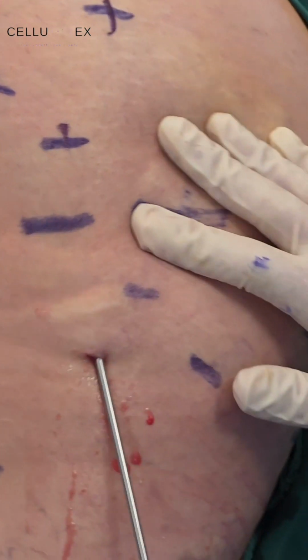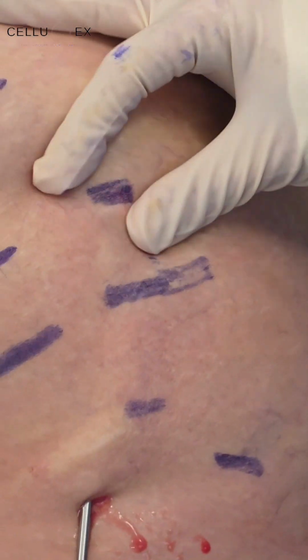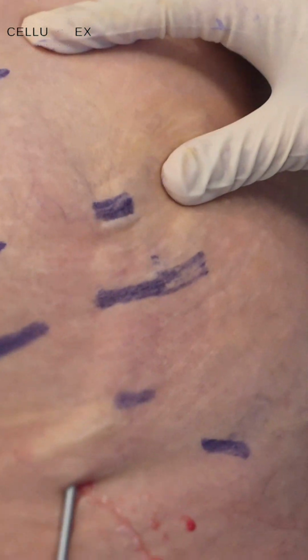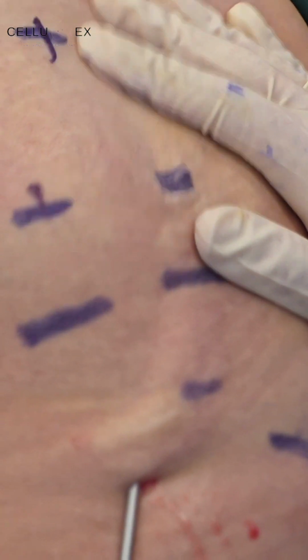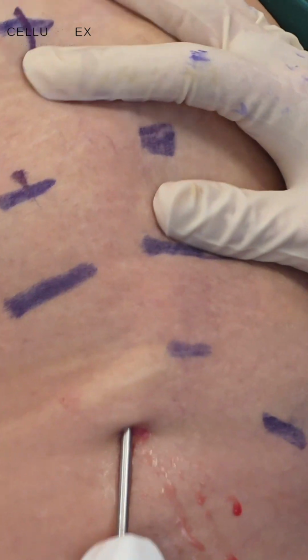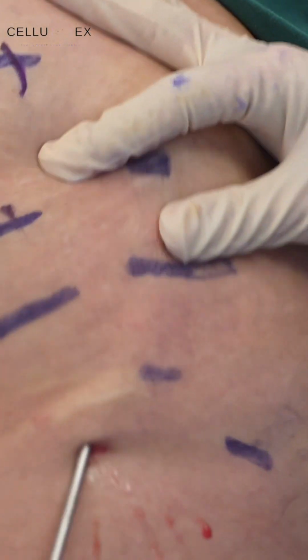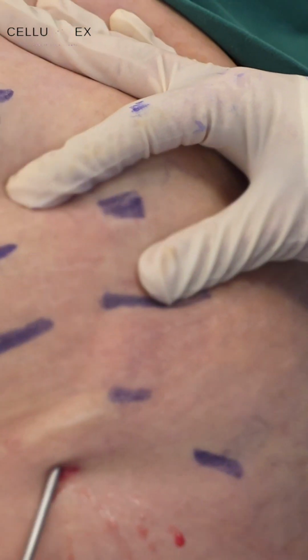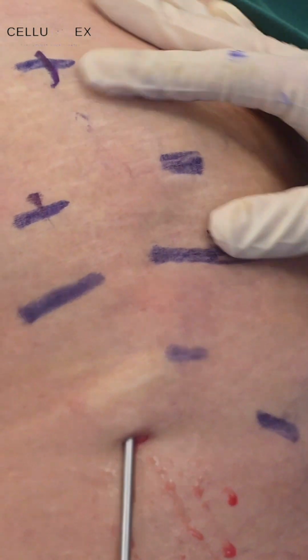Next one, I'll go to the next marked cellulite. I have reached there. I held the septum, now I have to cut it. Sometimes you hear the sound even. The procedure itself takes about 20 to 30 minutes maximum.